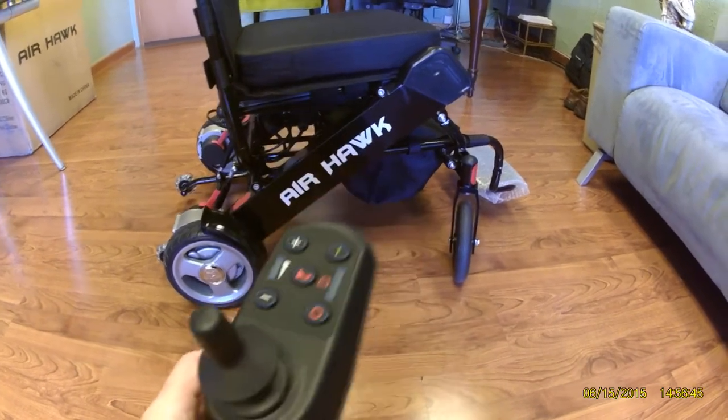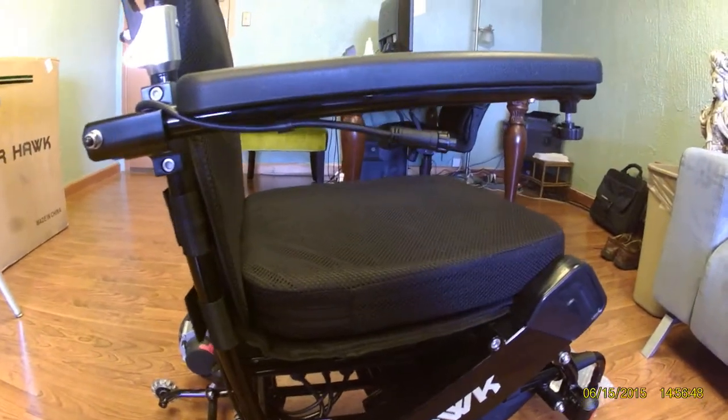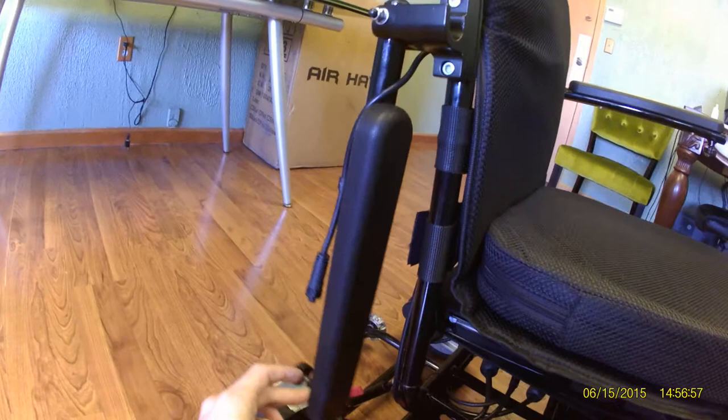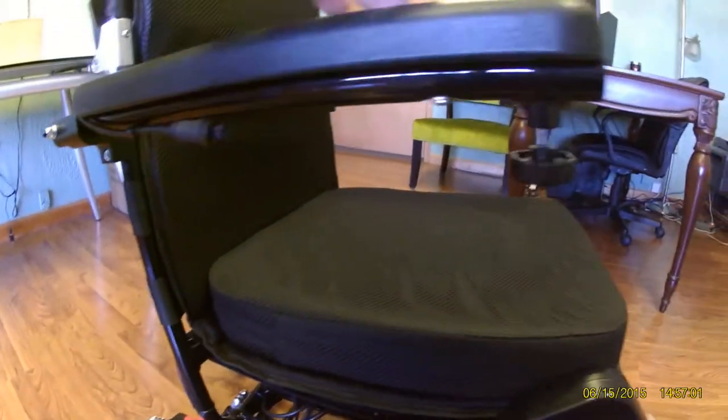The joystick itself is by default going to be mounted on the right side, or the right arm. You can also see how the arms of the Airhawk actually fold behind the unit themselves.